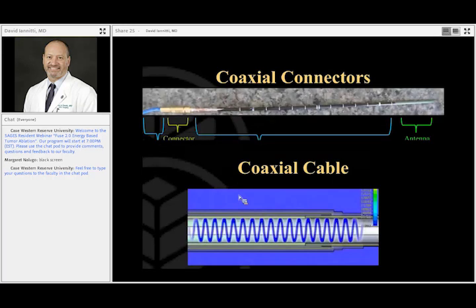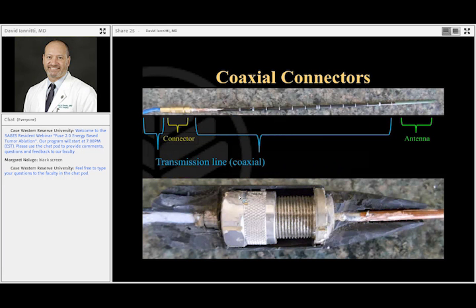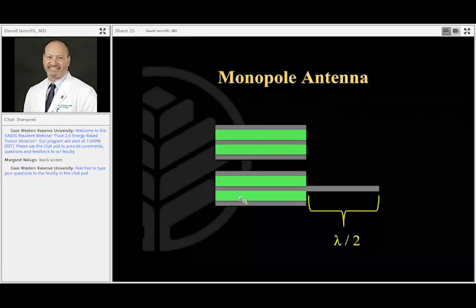Now we take apart a lot of these antennas, and you can see the conductors here. So now you've got the wave going down a transmission line, and now you want to put it into tissue. And so there are different antenna designs. And so very quickly, the most simple is a monopole.